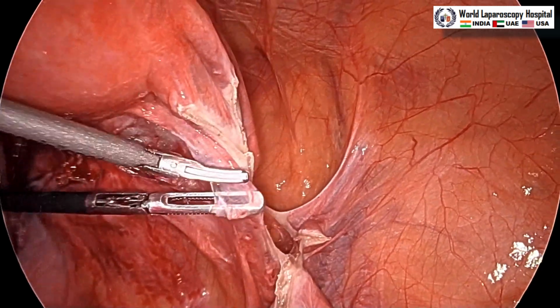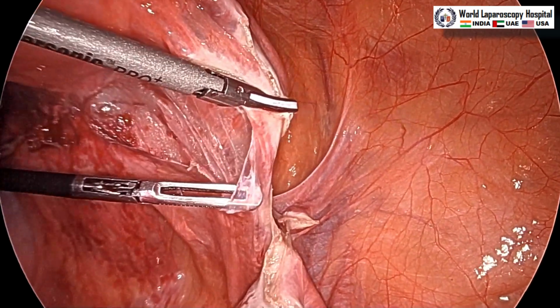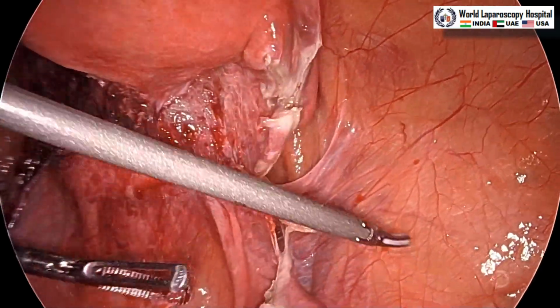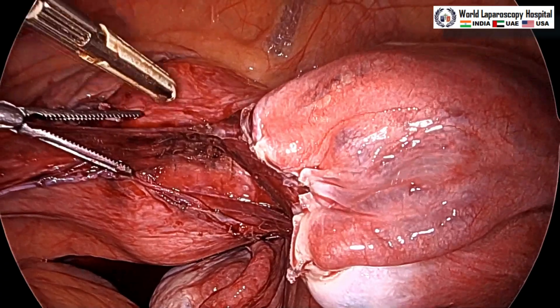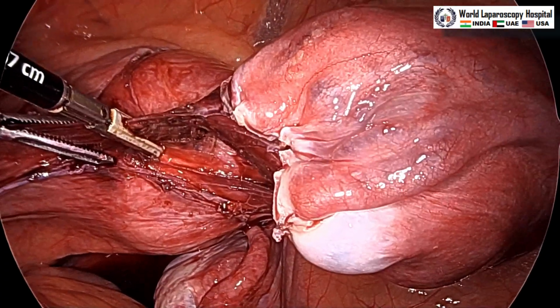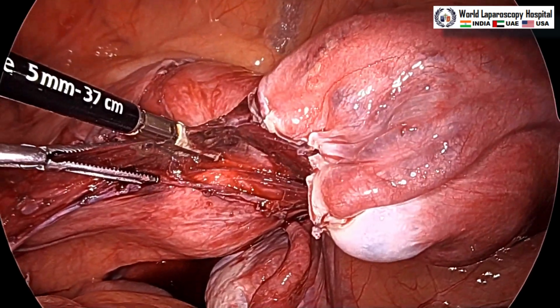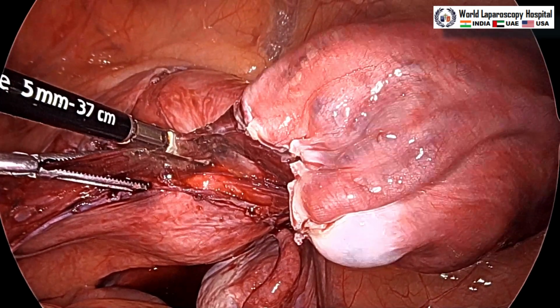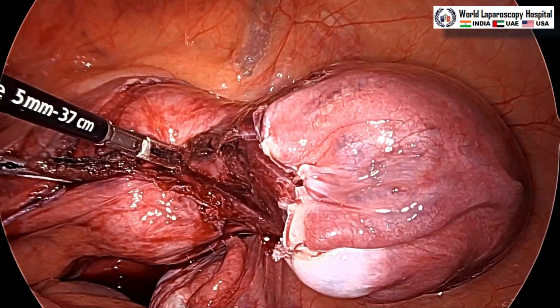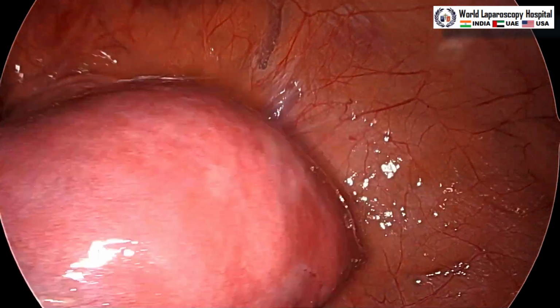So, in this patient, hysterectomy was very easy to perform because the ligaments were very loose, and the uterus is also, all the previous deliveries were vaginal. So, now we will take the uterine artery. This is the uterine artery of the left side, and the uterus is at the 3 o'clock position, so that once you do it, you will have the proper vision, and the uterine artery of the left is over. After that, we will take the uterine artery of the right side.